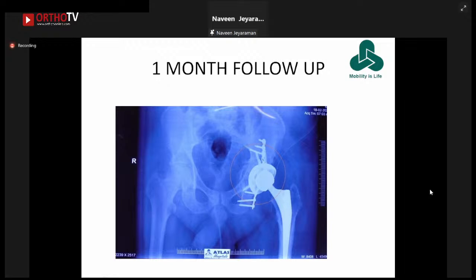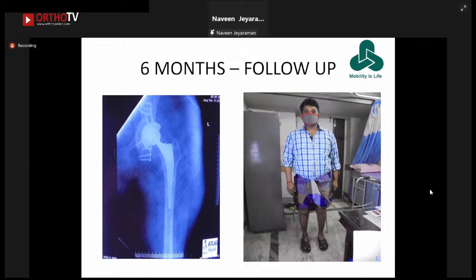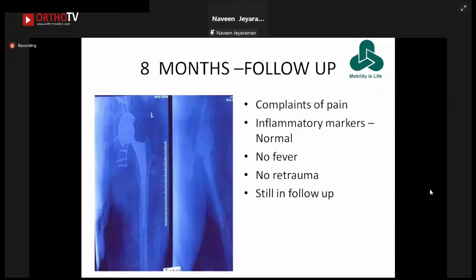and a stable implant. This is the 6 month follow-up. The patient was happy. He was walking without support and he is able to do his job. This is the 8 month follow-up. The patient came again with pain. Inflammatory markers were negative. No history of fever, no history of re-trauma. We just managed conservatively by giving analgesics and some physical exercises, and still he is in close follow-up.